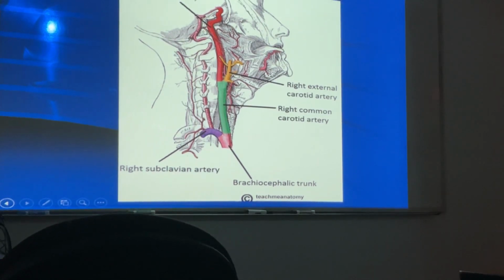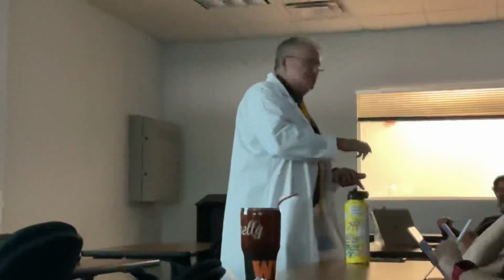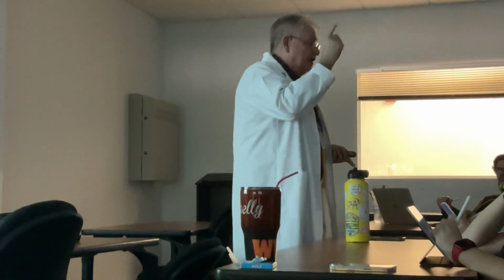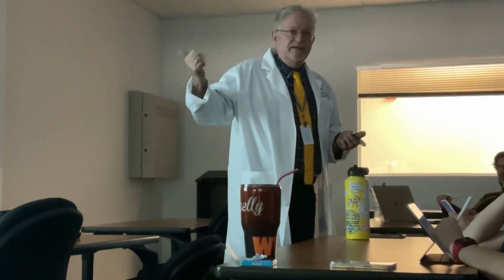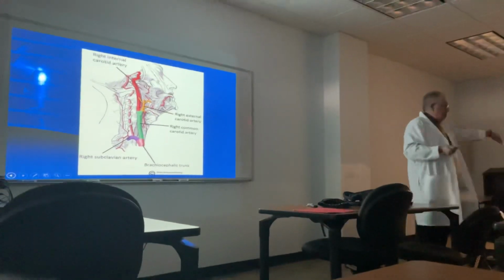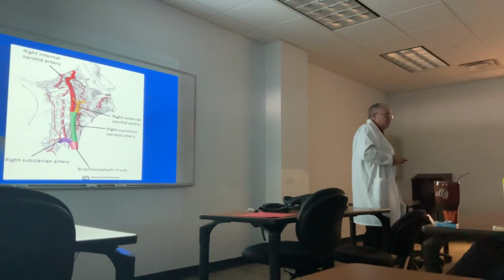Potential dissection, embolism, stroke. Okay, this doesn't do anything, but that force can cause some of that calcific flaking to dislodge and then migrate superiorly. The chiropractor gets blamed because you caused the stroke. No, you didn't cause the stroke, they were pre-existing. They have comorbidities. So the calcification that you see on the x-ray anterior to the vertebral bodies tells you something, especially when the patient says, I get dizzy when you turn my head.